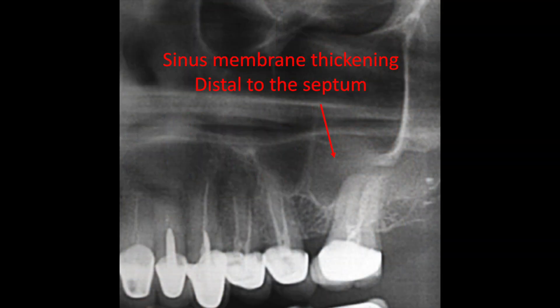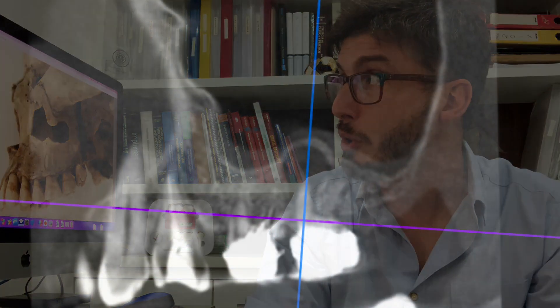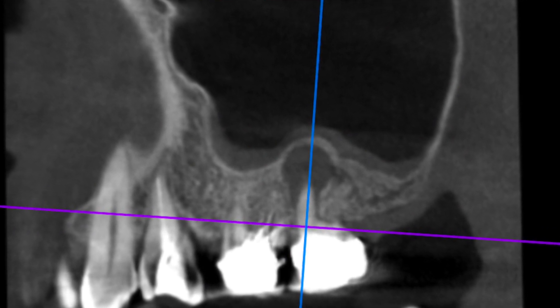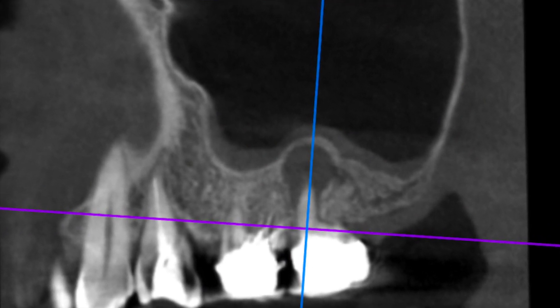There are several pathologies that can happen in the sinus, but most of them are related to the sinus membrane, which is known as the Schneider membrane. Here in this sagittal slice of a CBCT, we can see the contour of the sinus membrane following the contour of the sinus floor, which is being pushed by a periapical lesion.